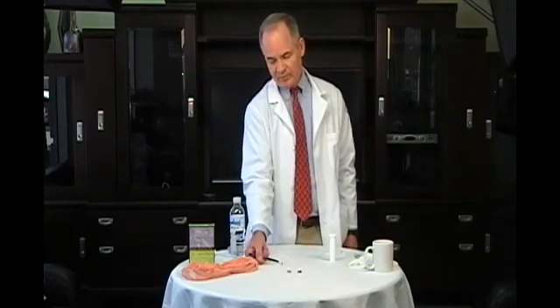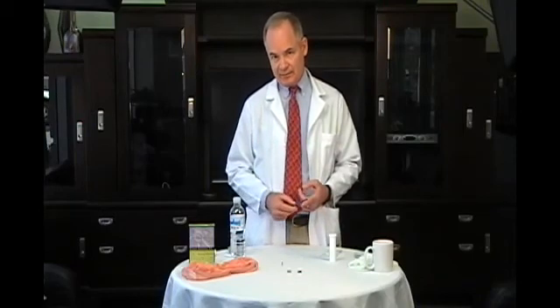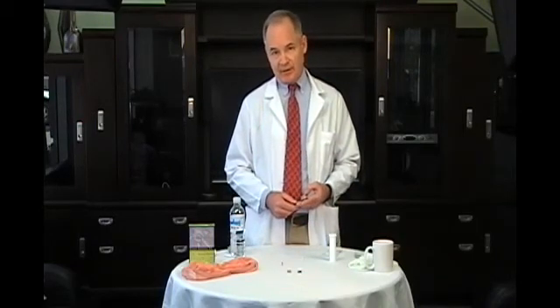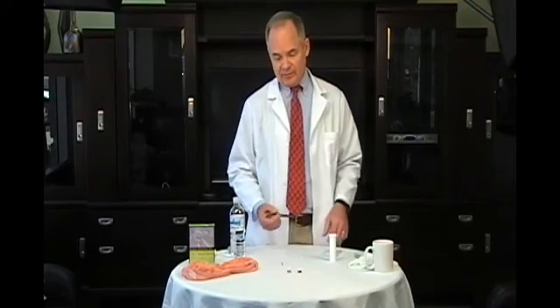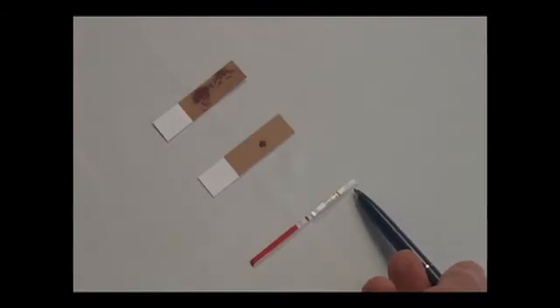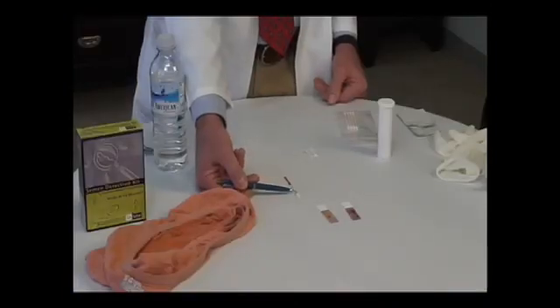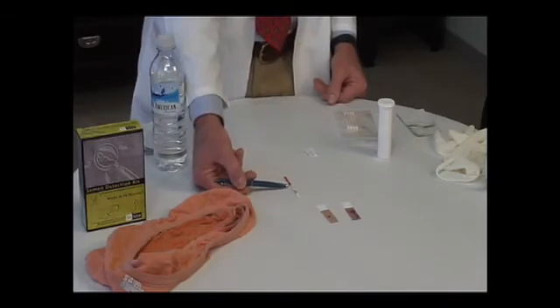Now, this test strip works by having 3 different antibodies. One antibody is an antibody to PSA. The second is an anti-human antibody, and the third is an anti-mouse antibody. When you dip the test strip in water, the anti-PSA antibody is at the bottom. It complexes with PSA. That antibody is gold labeled and appears red. That antibody moves up the strip until it comes to the test region, where you have anti-human antibody bound to that region. If there's PSA there, that antibody complex binds to it and turns red. If there's no PSA there, it's blank.